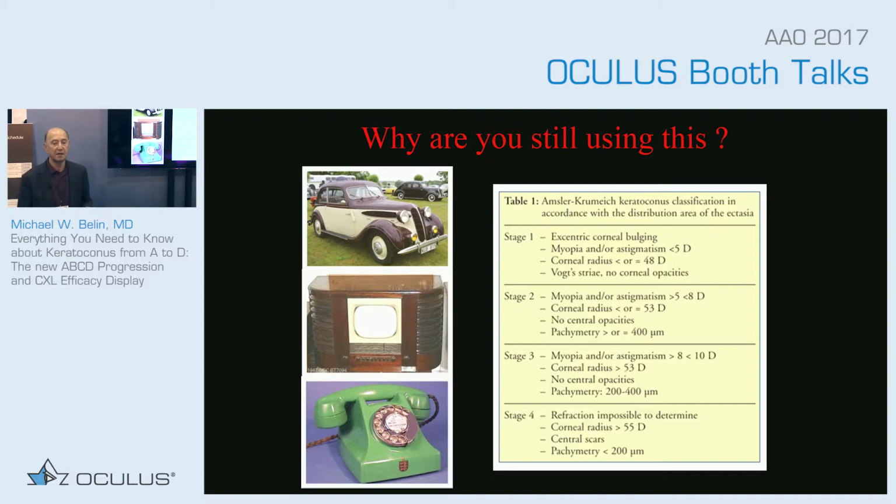First, it was based on optical pachymetry, which none of you have ever even seen, but probably, okay, and a keratometer. That's all it was based on. I know you have, right? Okay, yeah. Based on optical pachymetry and a keratometer. And it was developed when there were only two options: penetrating keratoplasty or contact lenses.